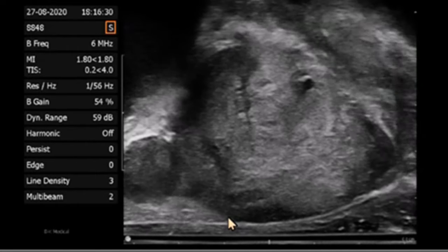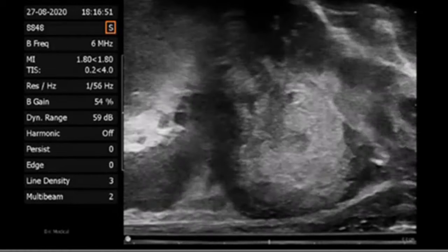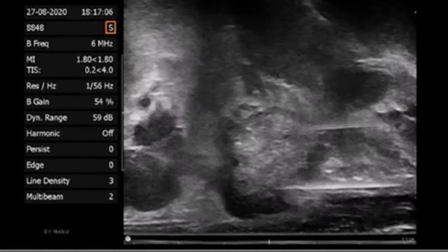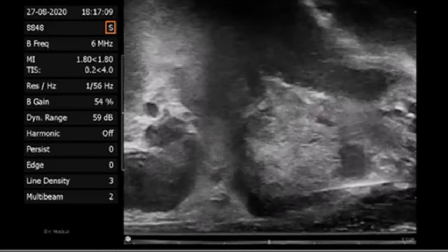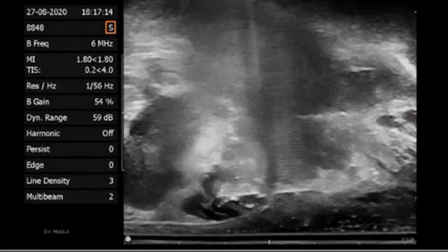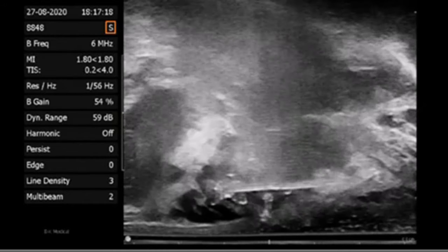This is also performed on the contralateral side. The prostate nerve block is finalized by injecting 5 cc's of 1% lidocaine between the seminal vesicles and lateral aspect of the prostate. The needle should be visualized as it passes between the rectal wall and posterior prostate. Lidocaine should be visualized expanding the distance between the seminal vesicles and prostate if given in the correct space. This is also performed on the contralateral side.